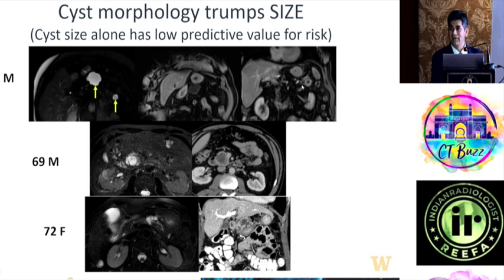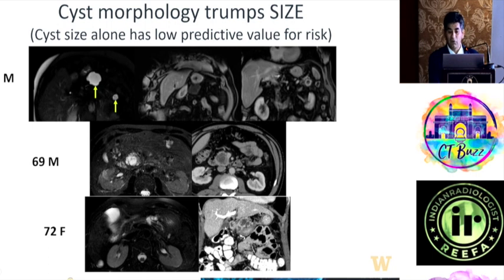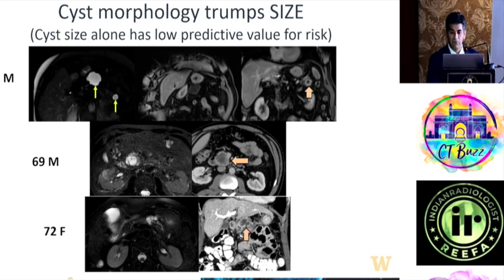Another case shows a 3 cm lesion — you focus on size, but the thick irregular margin is more important. And another: 3 cm side branch IPMN less than 3 cm, but look at the thick enhancing wall. Morphology trumps size. Always look at morphology first; only in the absence of concerning morphology and symptoms does size come into the picture.